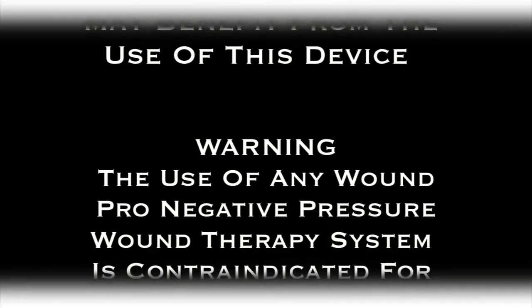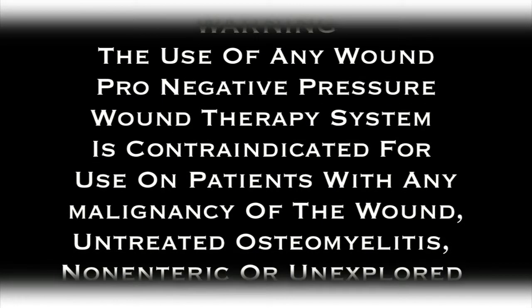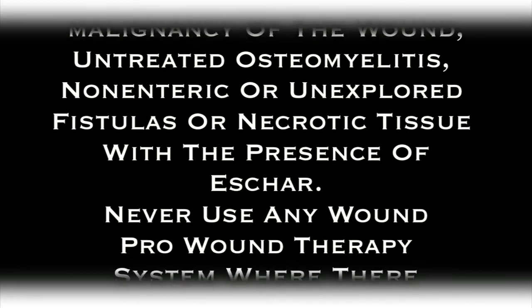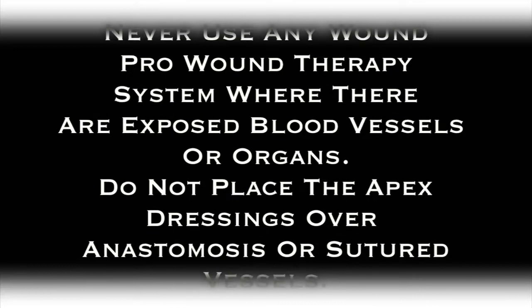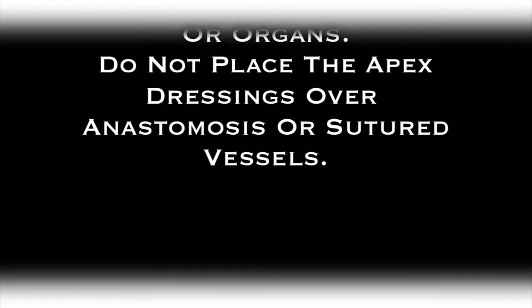Warning: the use of any WoundPro negative pressure wound therapy system is contraindicated for use on patients with any malignancy of the wound, untreated osteomyelitis, non-enteric or unexplored fistulas, or necrotic tissue with the presence of eschar. Never use any WoundPro wound therapy system where there are exposed blood vessels or organs. Do not place the Apex dressings over anastomosis or sutured vessels.